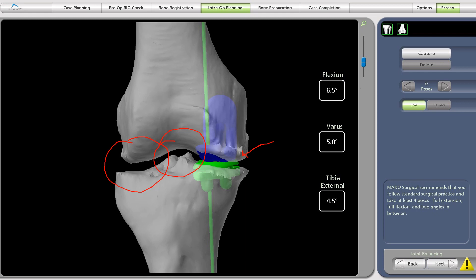We will then begin to focus on the area of deformity. In this patient, as we take it through balancing, we know there's a 6.5-degree flex contracture. This patient is in 5 degrees of varus, and that's why the mechanical axis between the hip, ankle, and knee is pushed so far over to the medial side — we typically want it right around the anterior tibial spine. We will then begin to place our implants virtually onto the patient, placing the femur and the tibia, checking fit, sizing, and alignment to make sure they're mated, and then checking overall mechanical alignment as well. We'll also show how we dynamically balance and confirm the position of these components.